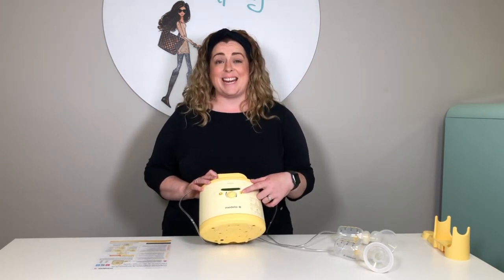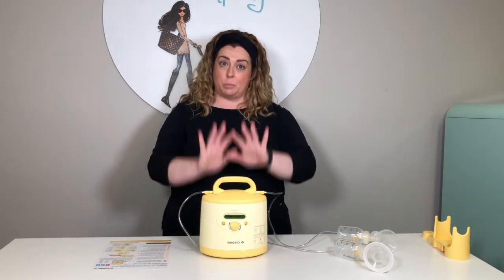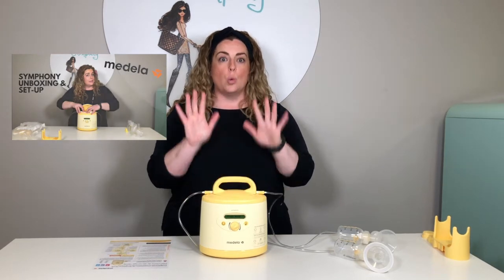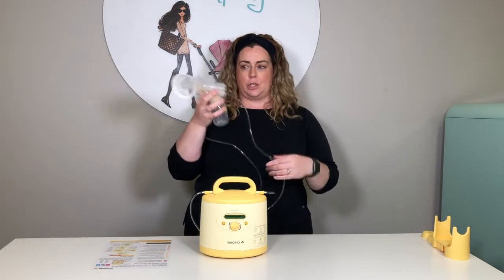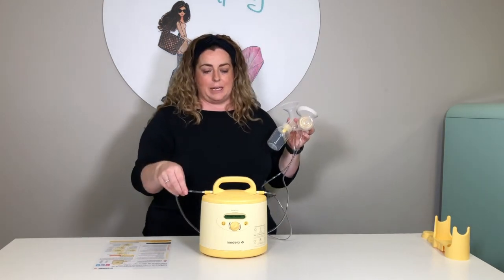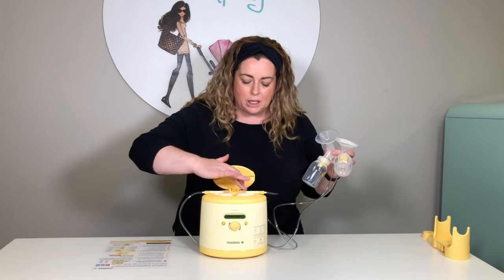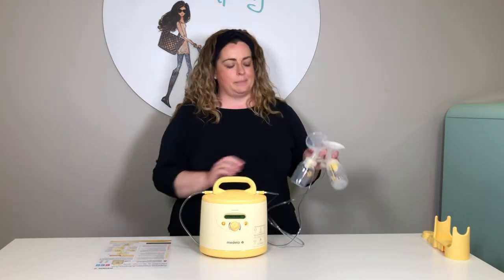Yeah, it's that easy. So in order to use this pump, first of all, you have to put it together. Check out our other video if you don't know how to put it together. Once you've put it together so that it looks like this, you've got your tube attached to your breast shield and bottle, you've got your valves and membranes included, the tubing is in correctly, no harm in giving the lid a little lift and just making sure that they're both in and secure, and close that down.